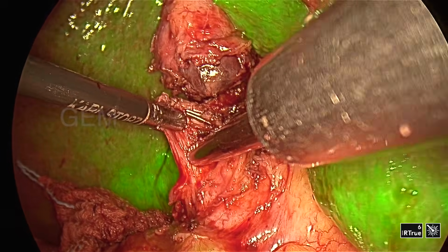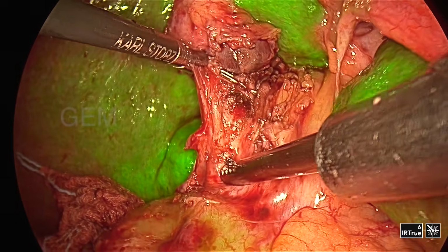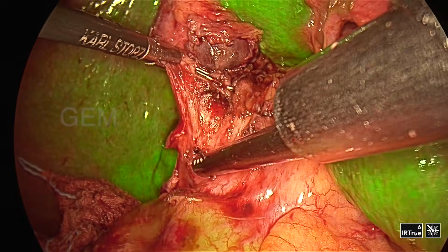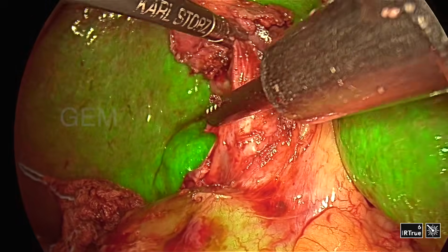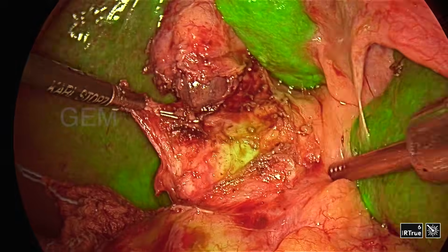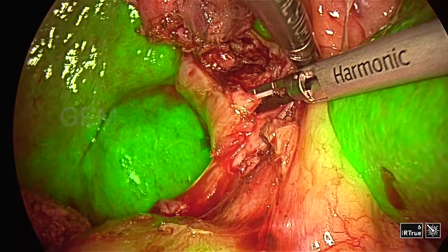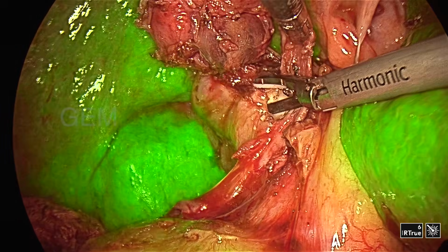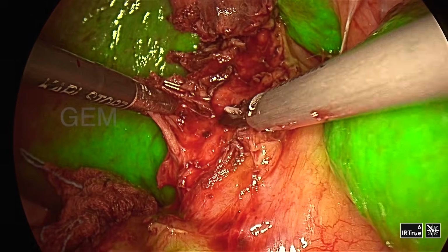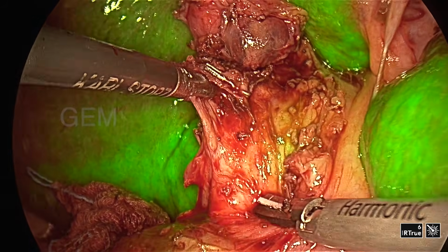So that is the CBD, and what I am holding is the cystic duct. There is no plane between them, and that area I feel very hard. With the suction nozzle I am just touching, the stone might be there. You can see how far down it is, more than 5 centimeters down from the infundibulocystic junction I divided. I am seeing the right hepatic duct on and off. So our aim is to take the entire gallbladder and remove the stone without injuring any structure. So that's why check all the areas clearly and then go for division.